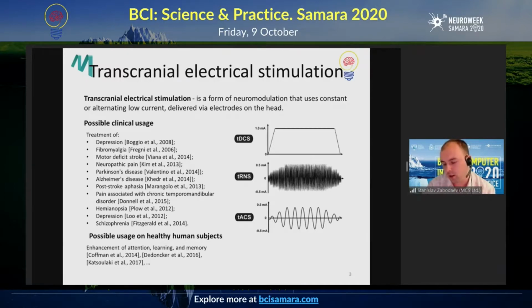This magnetic field is usually focused, and it is able to penetrate deep into the brain to induce electric current in the brain tissue. This can produce certain neurological effects due to the induction of electric current and the shift of electric activity in neurons.